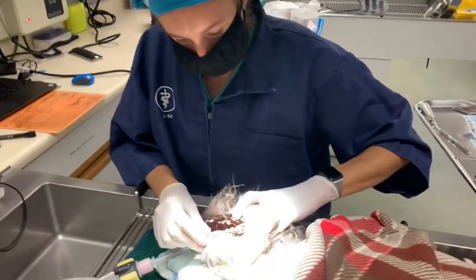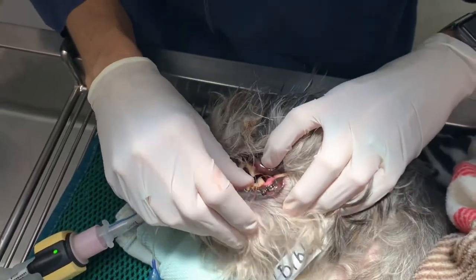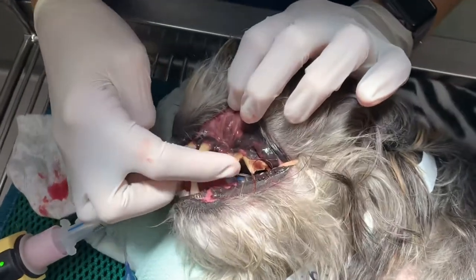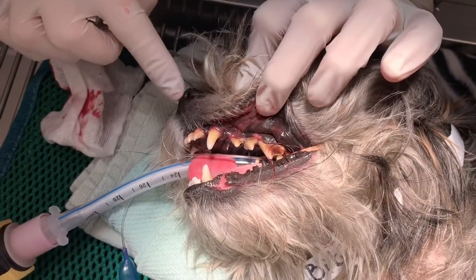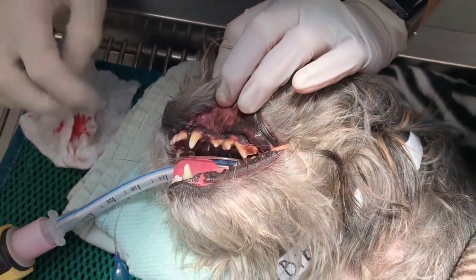I just started to pull this gingiva back, but if you move the jaw, there's instability here. He's also got some severe dental disease. When we were probing these teeth, we actually started to get some bloody nasal discharge out of this left nostril, which tells me that these also communicate with the sinus cavity.